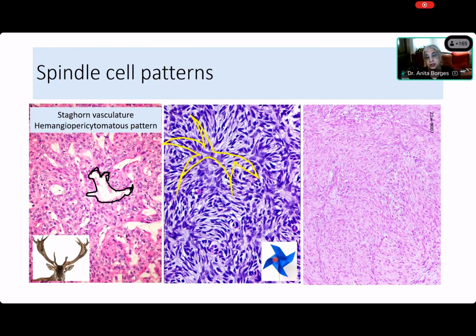The next one is this. You see this? What we used to use as kids. I don't know if you still use that. It's like a little wind whirl. Paper fans that we used to take, and run. And you can see how well it matches what you are seeing. There is a condensed point of collagen, usually it is collagen, where all the cells come together, and then they whirl away from this particular central point. Okay.